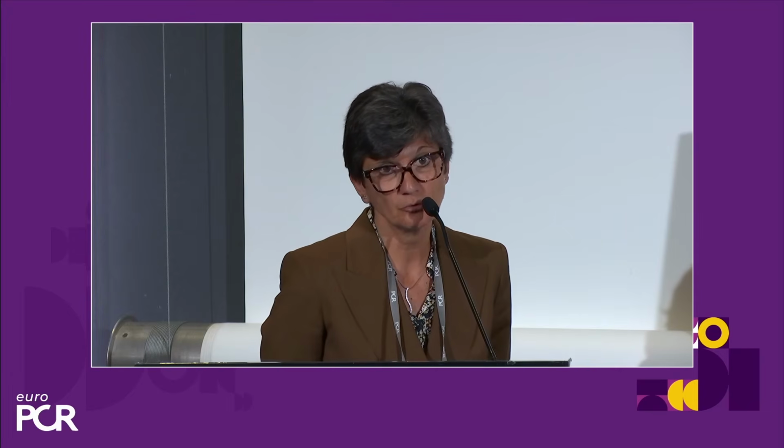Short one. In this foggy scenario, which is really beautiful, we are speculating a lot, but actually we are not able to conclude. My question is, did you observe differences between men and women? Women are known to have more autoimmune processes. Is there any difference in terms of HALT in women rather than in men? Thank you. Some observational studies suggest that HALT is more frequently observed in men. So men look like a risk factor, but once again, it's observational studies.